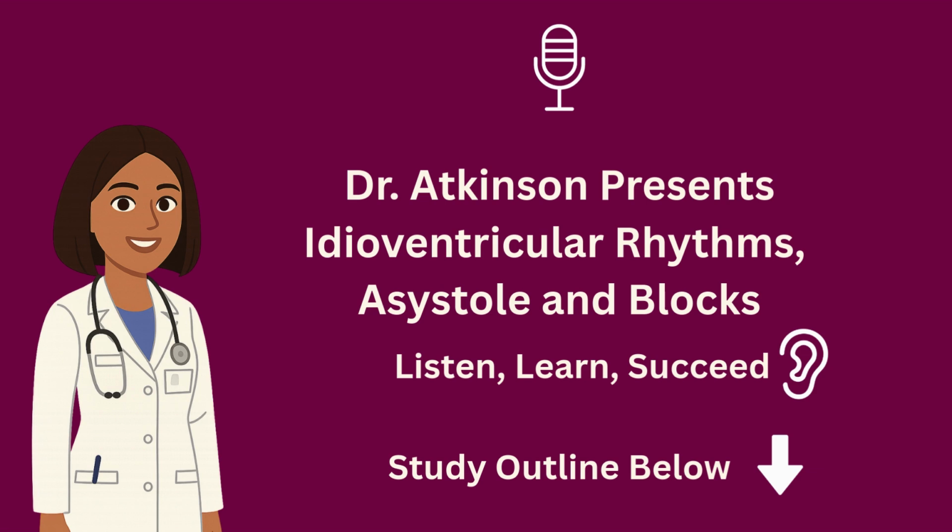Second-degree AV block type 2 is more worrisome. Here, some atrial impulses are blocked entirely, while others get through, but the PR intervals of the conducted beats stay constant. You might see 2 P waves for every QRS, or 3:1, or even higher ratios. Because this can progress suddenly to complete heart block, it often requires pacing.